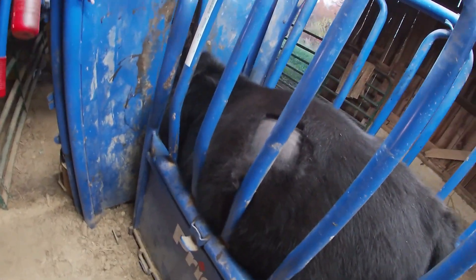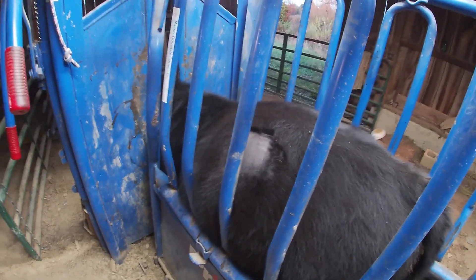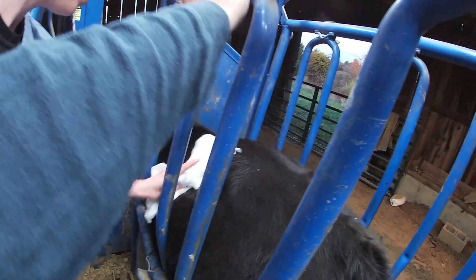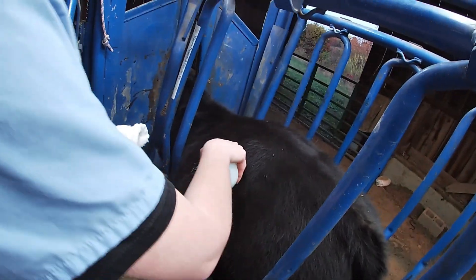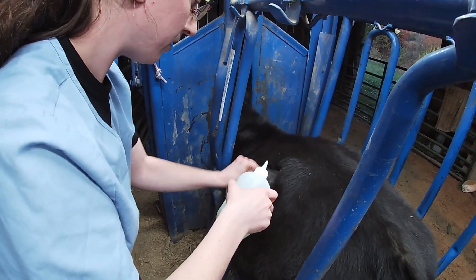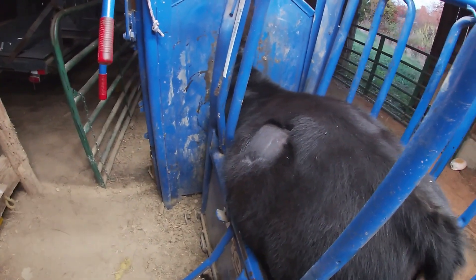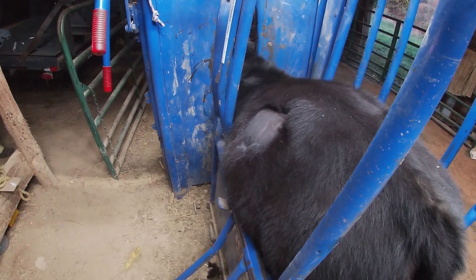I tubed him last night and within two seconds the bloat was back. I've never had one bloat this quick, especially with the medicine already in him. I'm wondering — when I put the tube down there was serious resistance, I had to really force it in. I think he might have something stuck in his esophagus and now it's swollen, making it harder to pass. When we tubed him last night the gas didn't even smell — typically it's foul. That's the trocar: basically just a vent so the gas can come out.